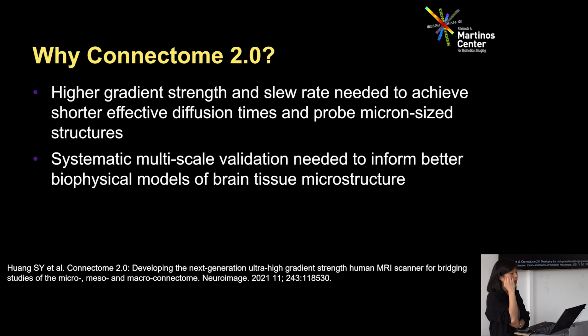And I think you've seen today from the brief talks that we got in the beginning, the brief hellos, that there's still a lot that can be understood about tissue microstructure in general, not just in the brain, but also in the body, for example in the prostate, to better inform our understanding of the mapping between the diffusion MRI signal and what we're seeing in the tissue.